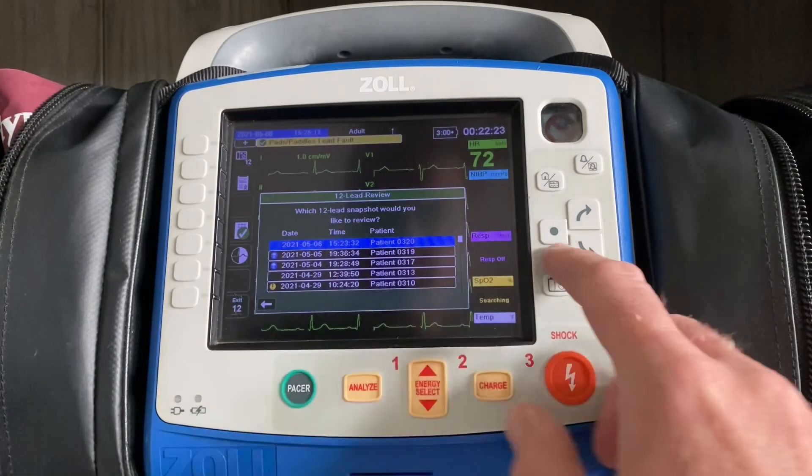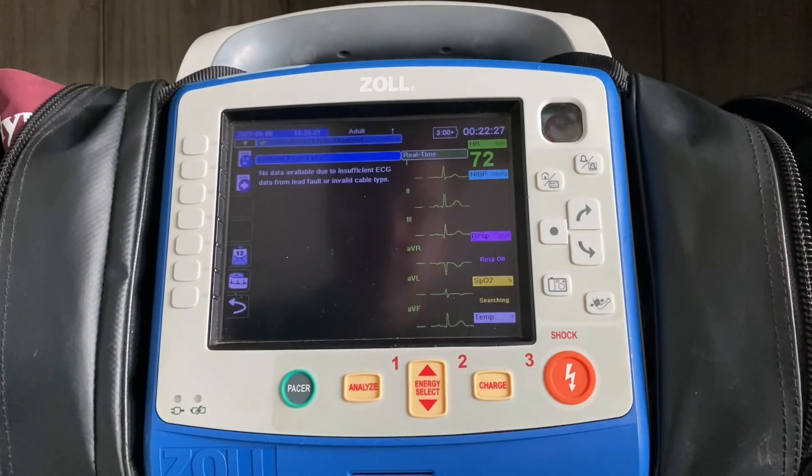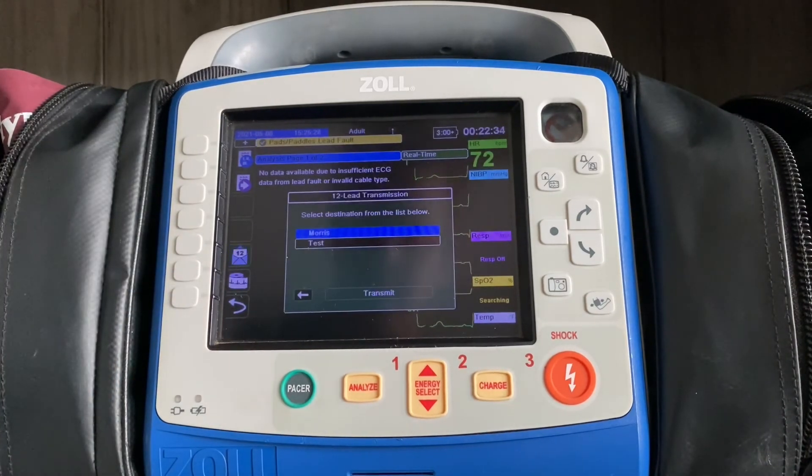If for some reason it didn't go through — for example on the bottom right here — you could hit select, pull that 12-lead up as if you had just acquired it, and then choose to either print it or transmit it again, just like you did before.